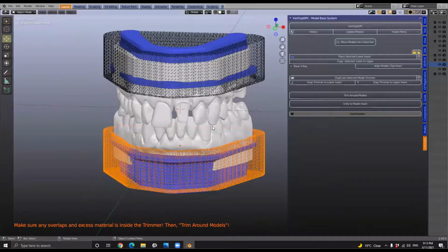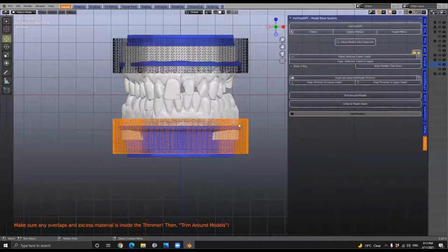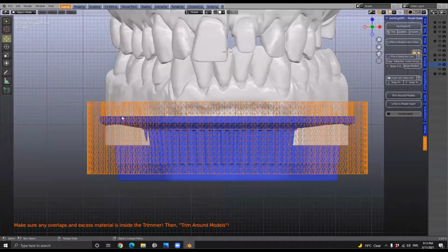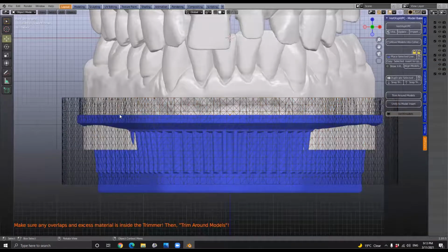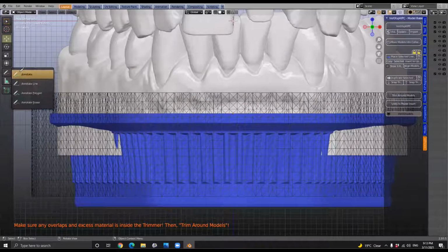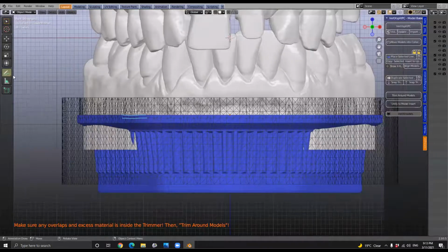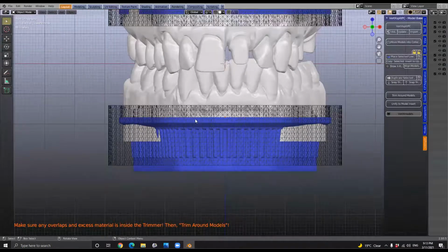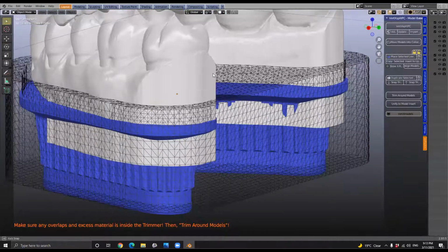So if I look at it in the front view, and we zoom in close, can you just explain to us how this works then? We've got a line over here. So you've got the first step of the insert, the blue insert, which is virtually the mounting area. Everything below that will be trimmed by the cutter. So when Michael's finished the cut, you'll clearly see all of the excess will be trimmed away. We're looking at the excess over here. That's all going to be trimmed away also on the top.